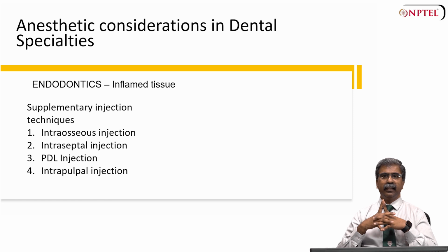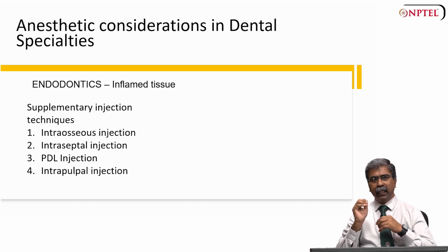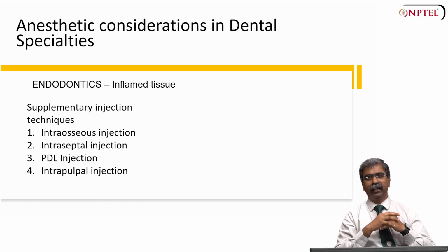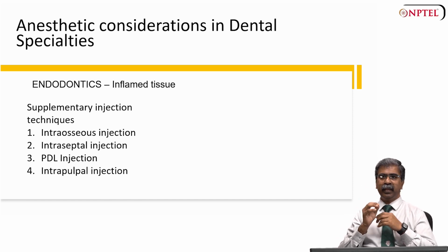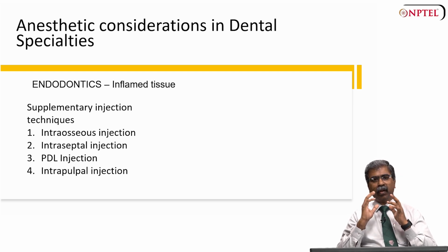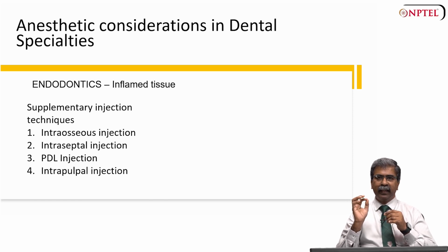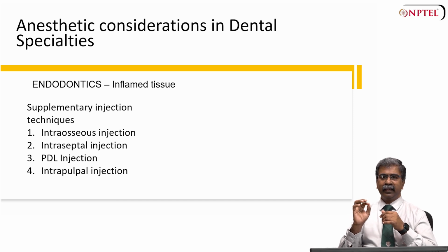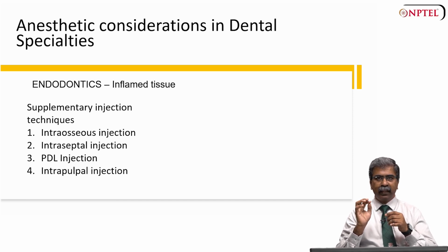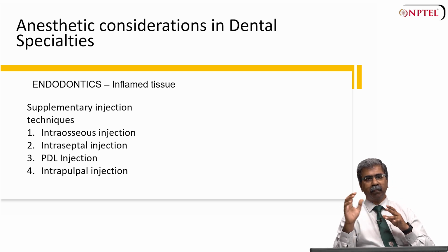Supplementary injections like intraosseous injection techniques, intraseptal injection techniques, a periodontal ligament injection technique, or an intrapulpal injection can be used to achieve anesthesia. Sometimes your block will be working perfectly all right, and when you open a root canal and go near the pulp, the patient will have severe pain because of the inflamed pulp. In such situations, give an intrapulpal injection.